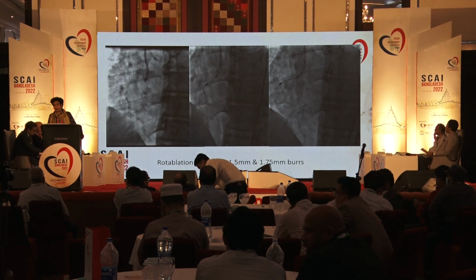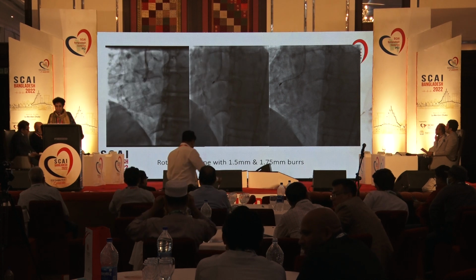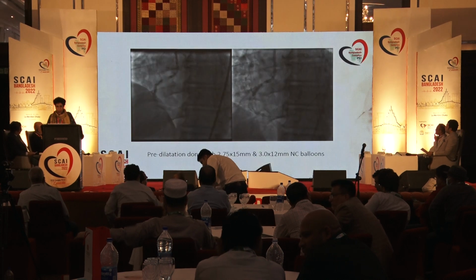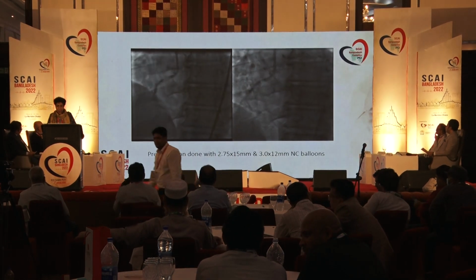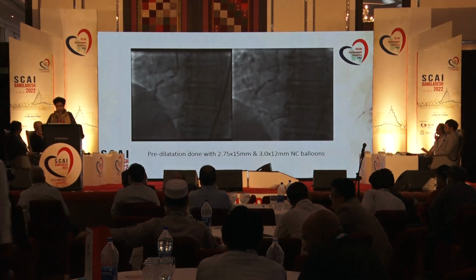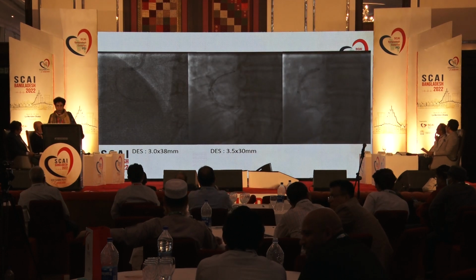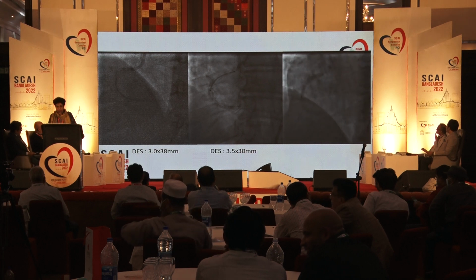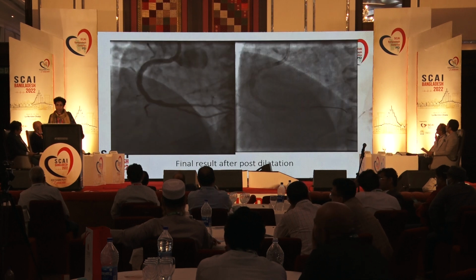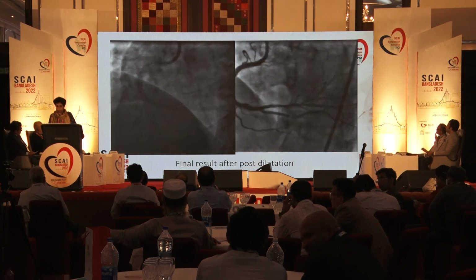That we had to step up our burr. First from a 1.5 we went to a 1.75 burr. And after doing a proper job of rotablation, we went on to do pre-dilatation, and we did pre-dilatation with a 2.75 and then with a 3 millimeter NC balloon. We went up to high pressures, did a thorough job of preparing the vessel, and only then did we go and deploy our stent sequentially, did post-dilatation. And you will agree that this result would not have been possible if we had not used the rotor.